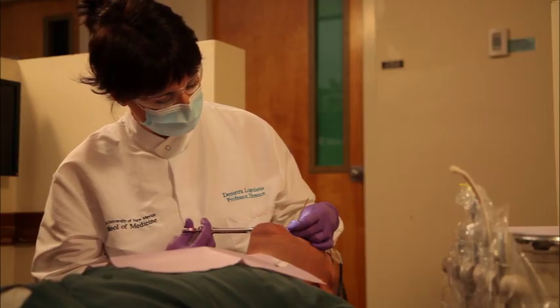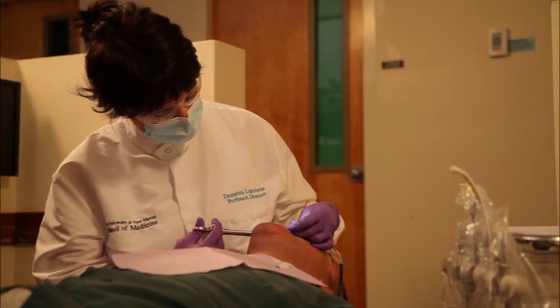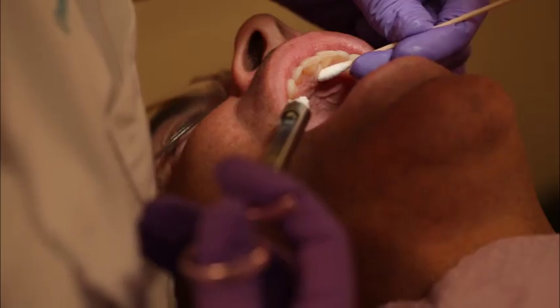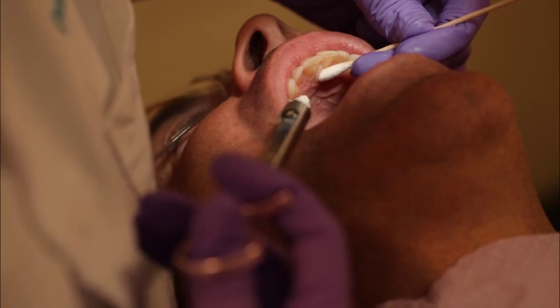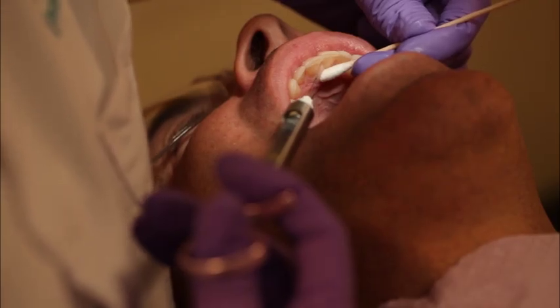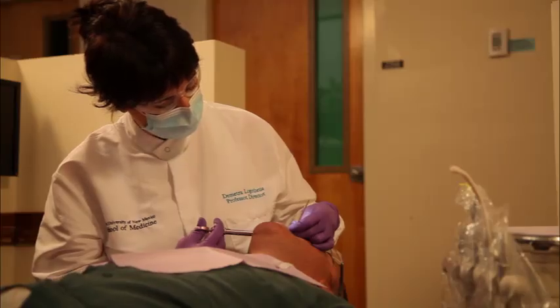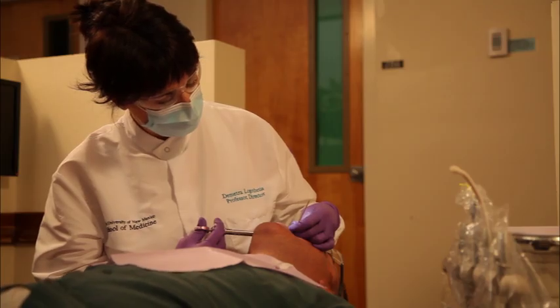Using a 27-gauge short or extra short needle with the syringe in the dominant hand, orient the bevel of the needle toward the hard palate. Using a new cotton tip applicator in the non-dominant hand, apply firm pressure directly to the contralateral side of the incisive papilla, away from yourself, until tissue is blanched, and maintain pressure with the applicator throughout the injection. Advise the patient that he may feel some slight discomfort from the pressure. Establish a fulcrum that allows you the greatest stability of the syringe.